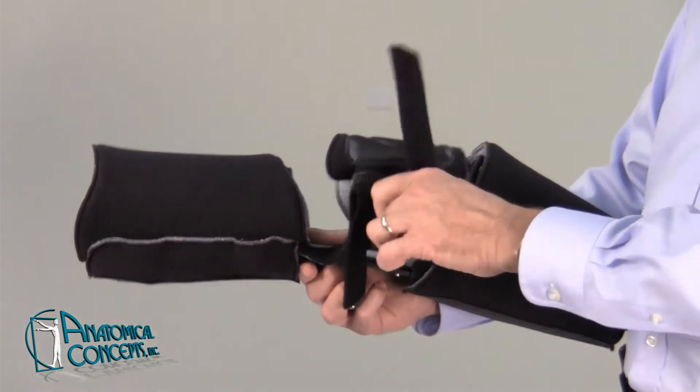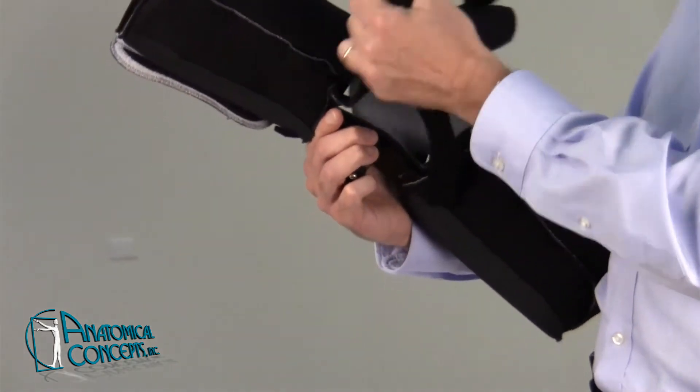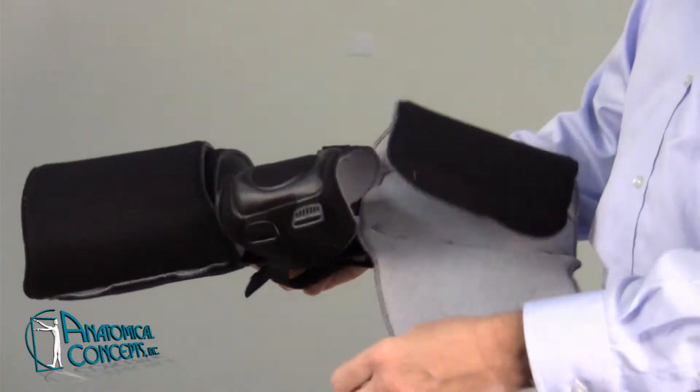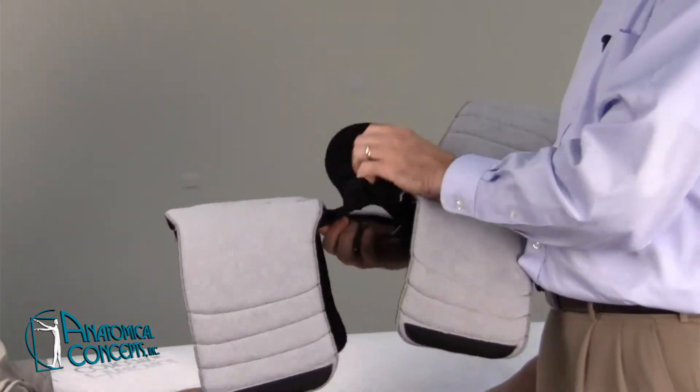You want to release all the straps, starting with the knee pad. Go ahead and release those and stick them back to each other so they don't get tangled up, and then go ahead and open the actual closures so you can get it out to its fullest length.